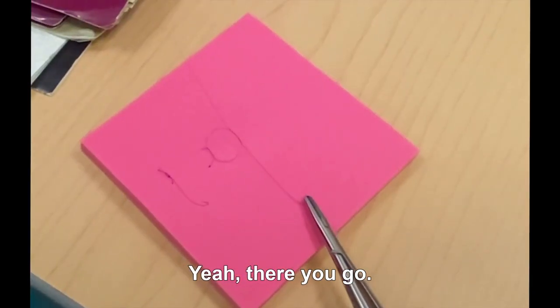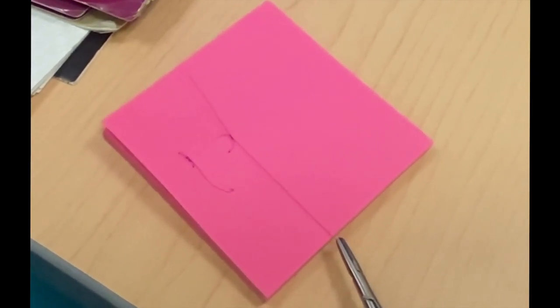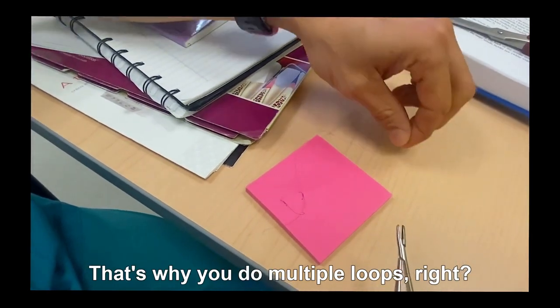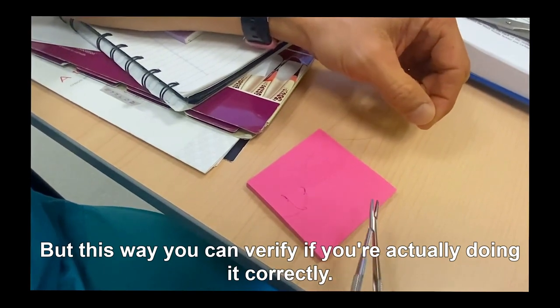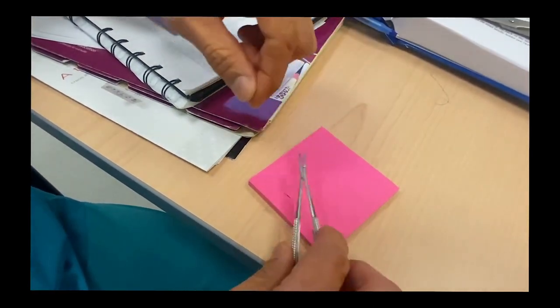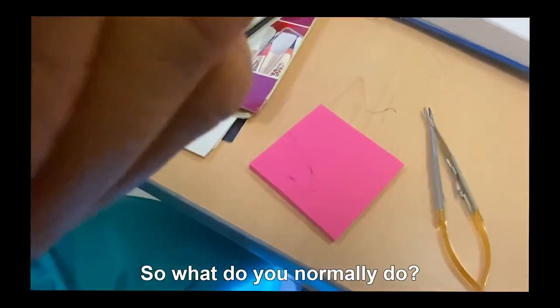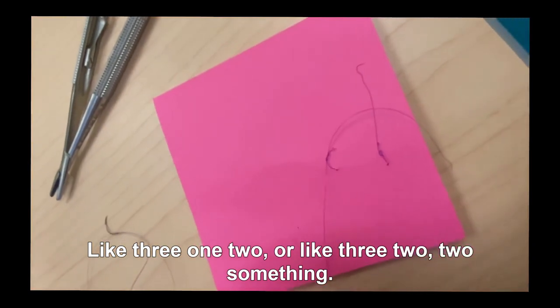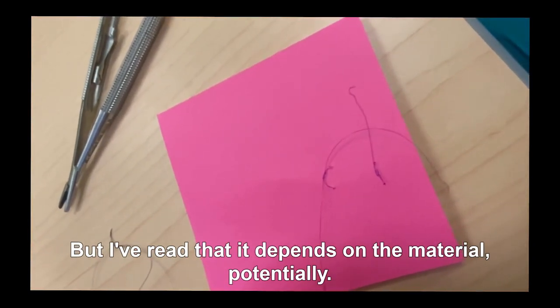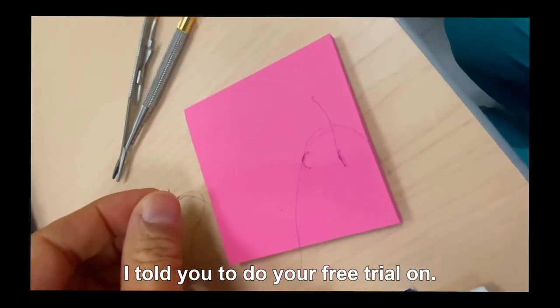There you go — so that's a square knot that will never come undone. Well, it could come undone, that's why you do multiple throws. But this way you can verify if you're actually doing it correctly. So what do you normally do — 3-1-2 or 3-2-2? Something like that, but I've read it depends on the material potentially. That's what I've been told — you need to do a free throw on certain materials.